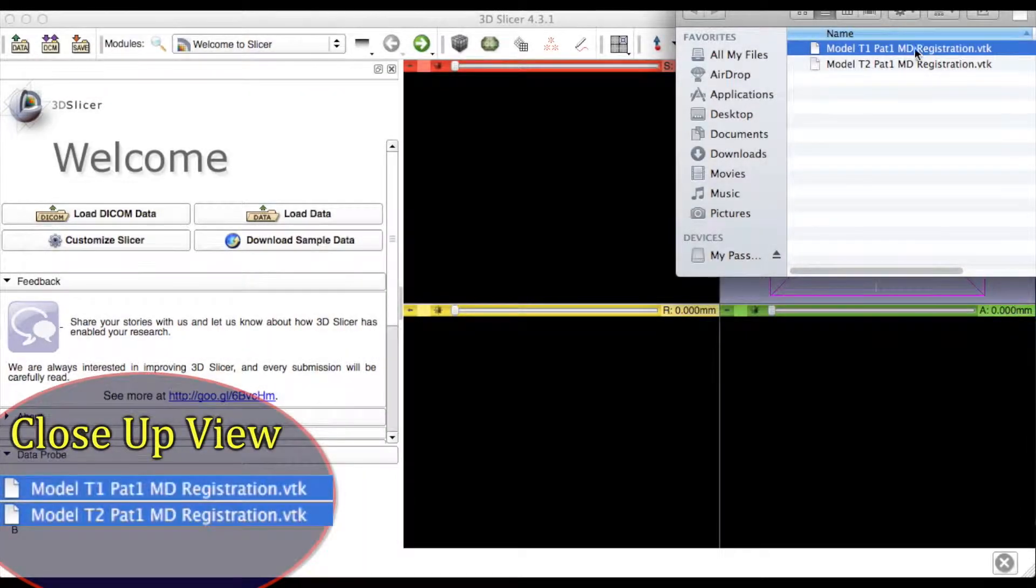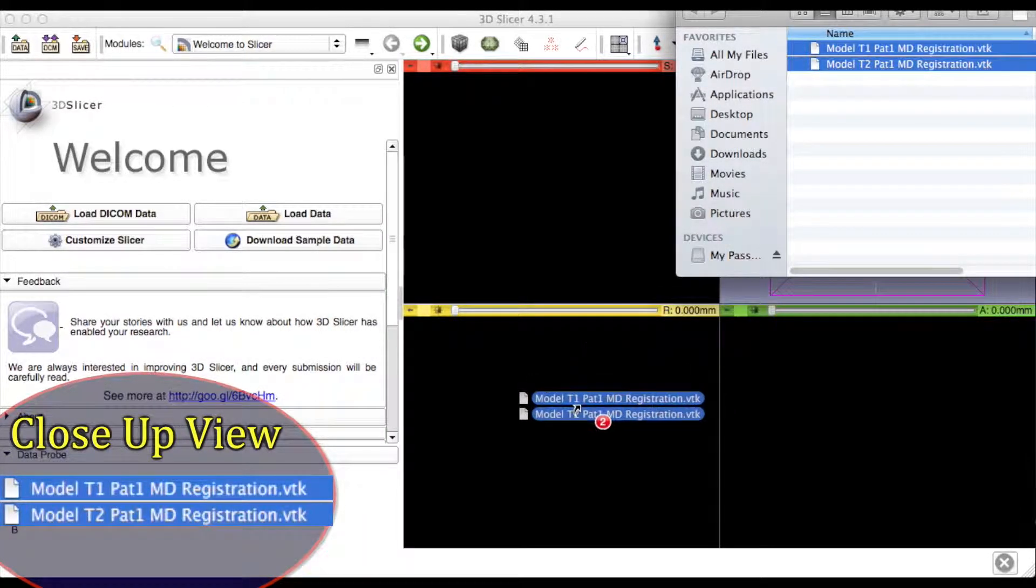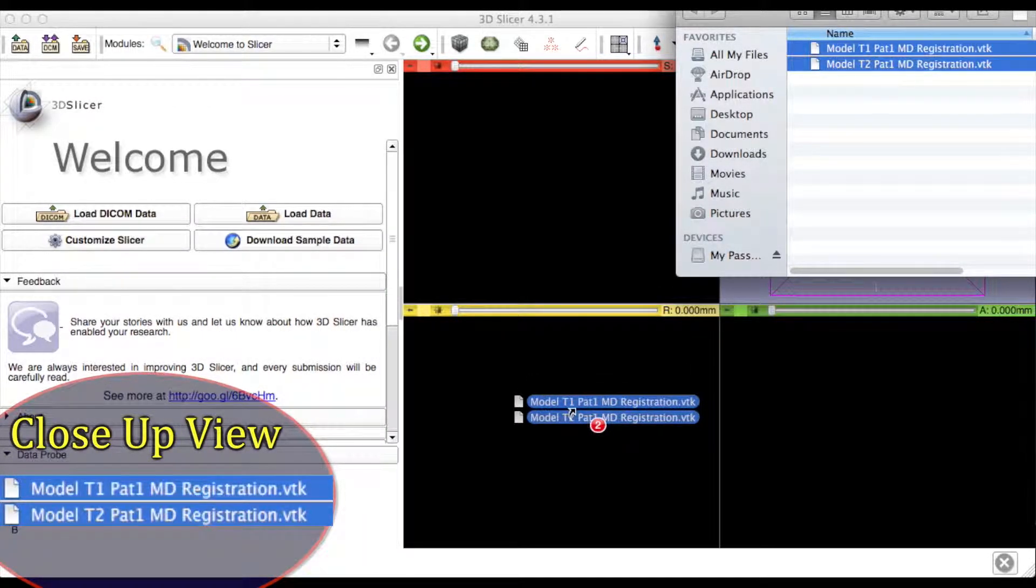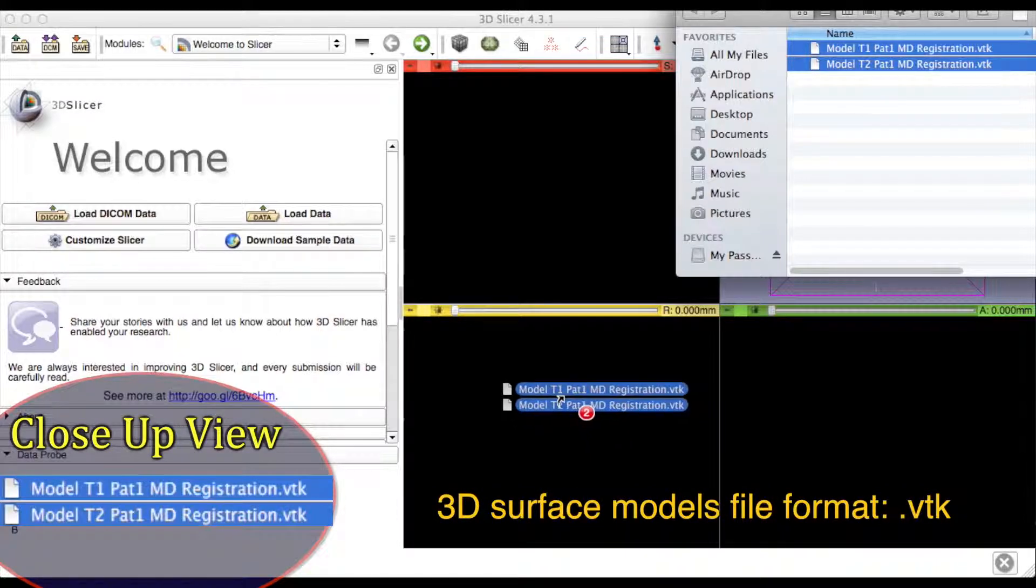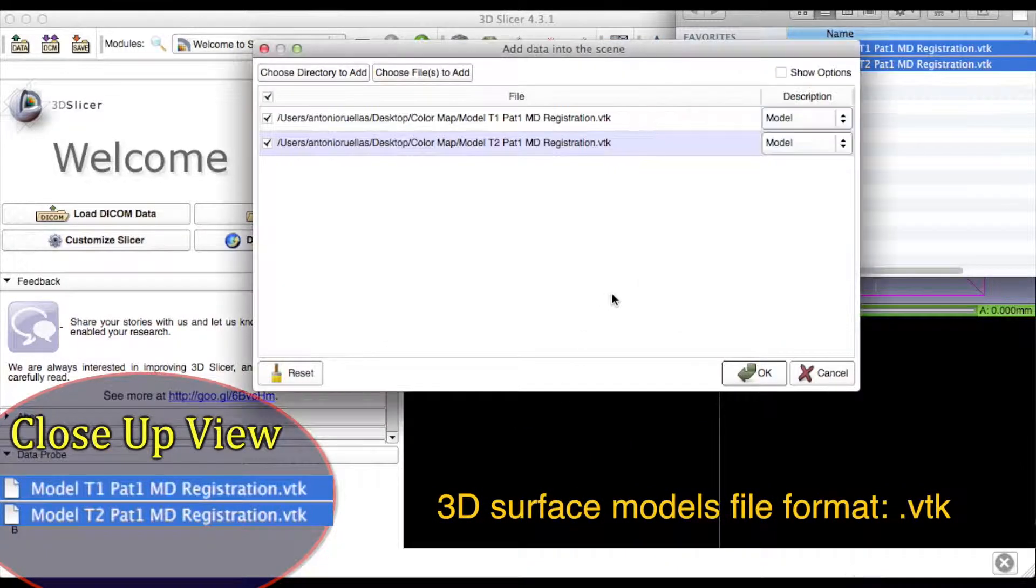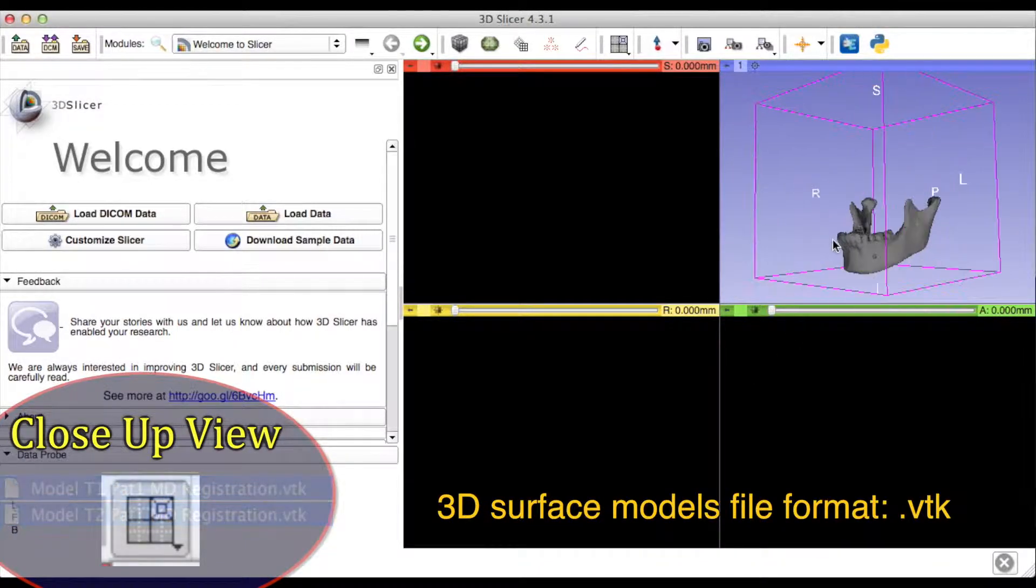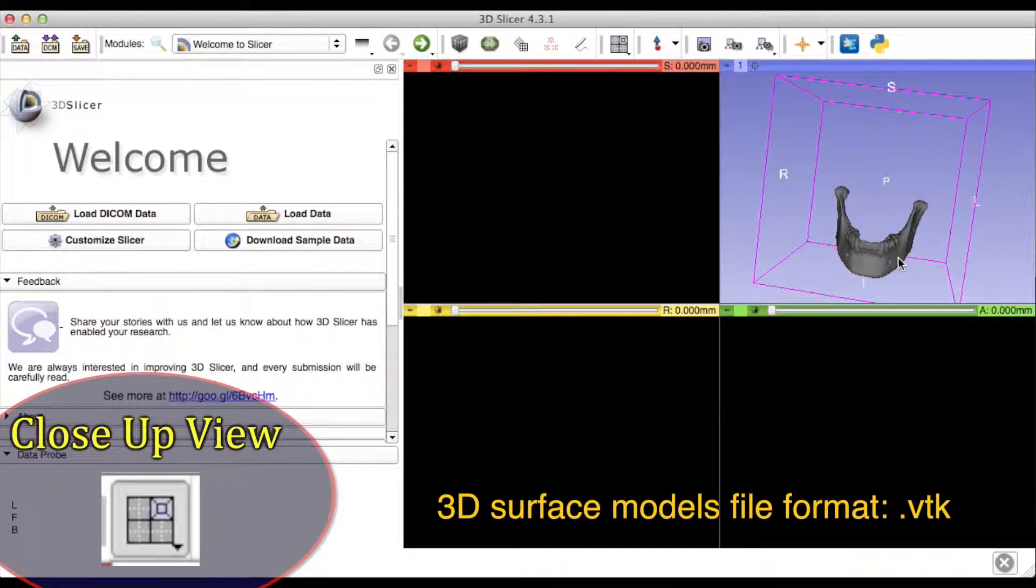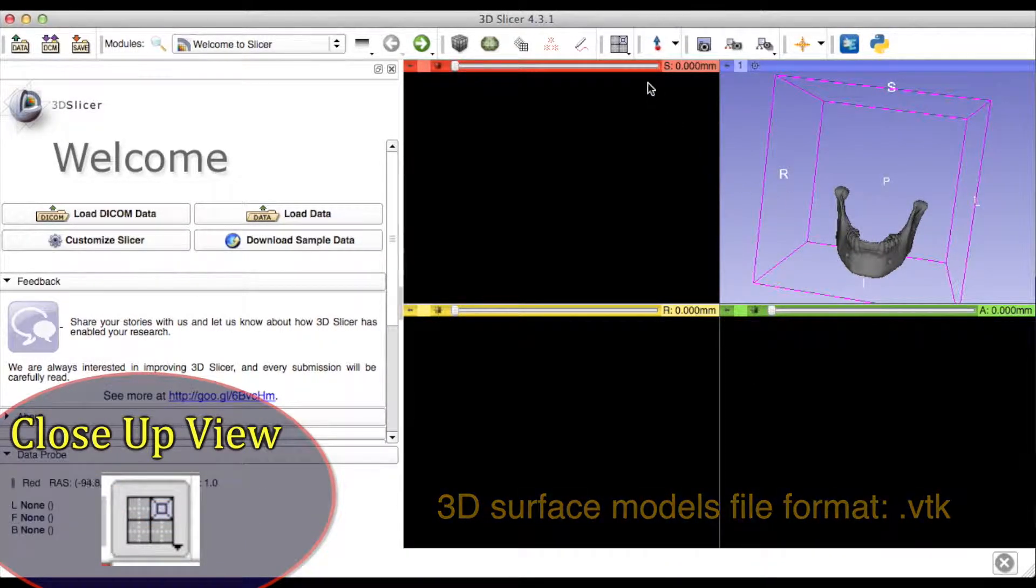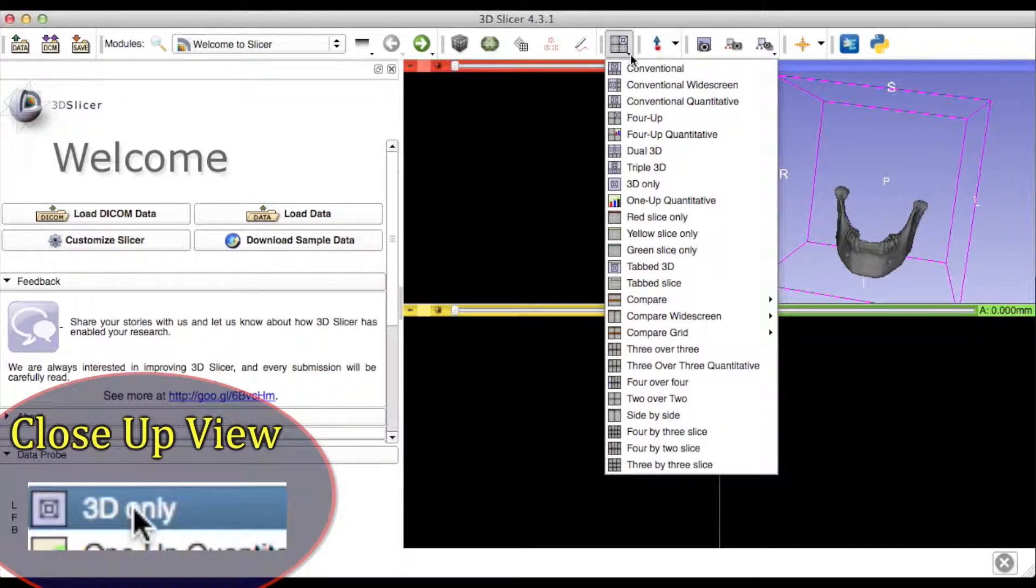Load the TimePoint surface modules, which are in a .vtk format, into 3D Slicer. You can always change the display to a 3D-only view.